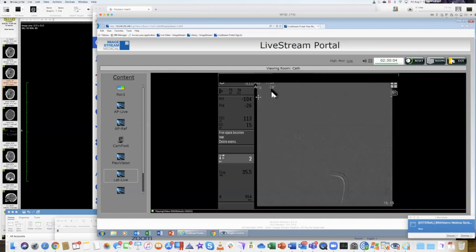Hi. What's happening? Is that right ACA washing out from the other side, or is that from the coil, you think? Okay, so that's not from the coil. Okay, I'm watching. All right, go ahead. Bye-bye.